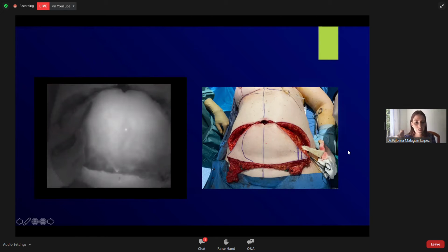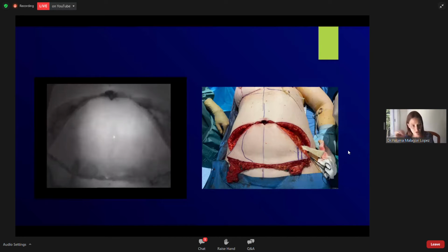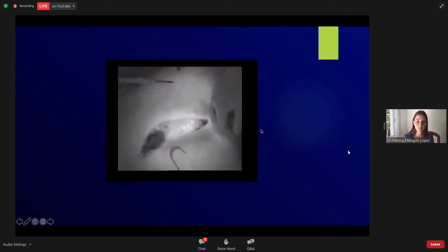With a sterile marker, we can mark the limit of the non-perfused and perfused areas of the DIEP flap. In this case, it was very clear where it is. And in this picture, we see that here we have one limit and here the other one. It was not a common DIEP flap reconstruction because, as you can see here, we have included lymph nodes, because this was a delayed breast reconstruction in a patient who has a lymphedema. So we put these nodes in the axilla along with the breast reconstruction with the DIEP flap.